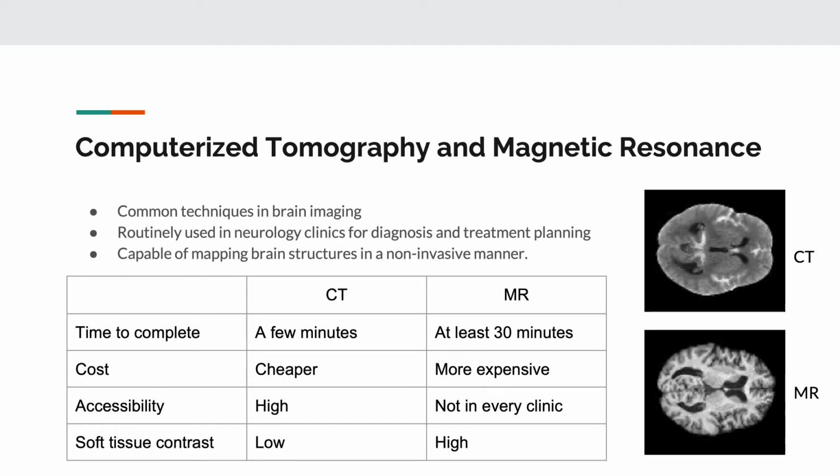However, MR scans usually have much higher quality in terms of clarity and soft tissue contrast. This made identifying different soft tissues in MR scans easier, and consequently, many techniques have been developed to automatically segment MR scans, but in comparison, very little has been done on CT images. To fill the gap in this field, in my final year project, we propose a segmentation pipeline that leverages generative adversarial networks to segment tissues such as gray matter, white matter, and cerebrospinal fluid from CT scans.